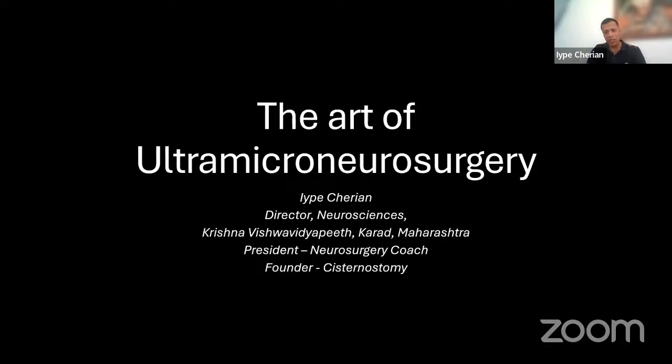Imagine, we had a 3D head also. We had a 3D head, we had ProMag, and then we sourced a 3-step magnification changer from an old microscope and put it onto the Pentero, and it screwed up the entire balance. So we had to send it back to Zeiss so that they could rebalance it. They rebalanced it and sent it to me, and probably that was the only Pentero that Zeiss had manufactured with a 40 zoom.